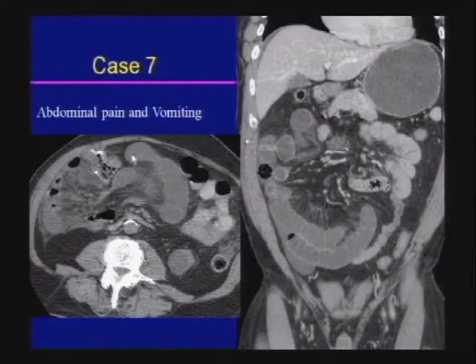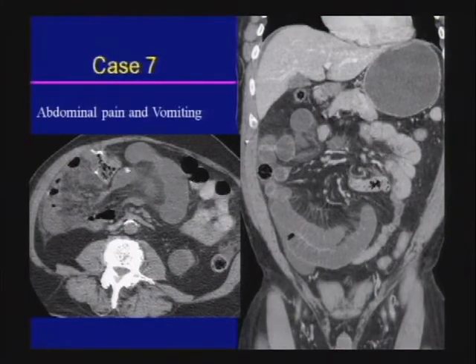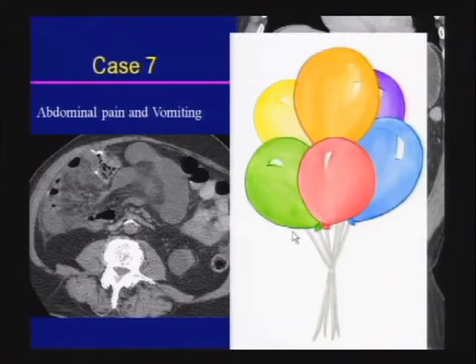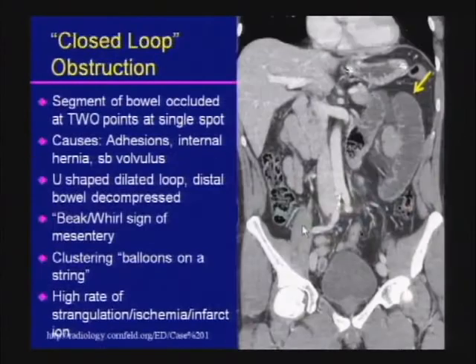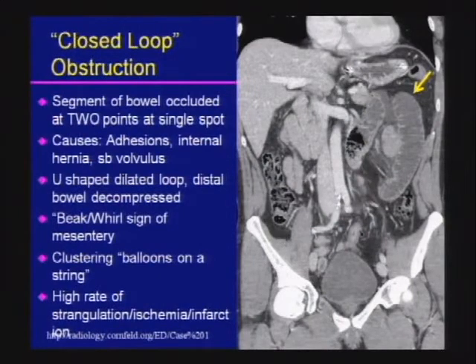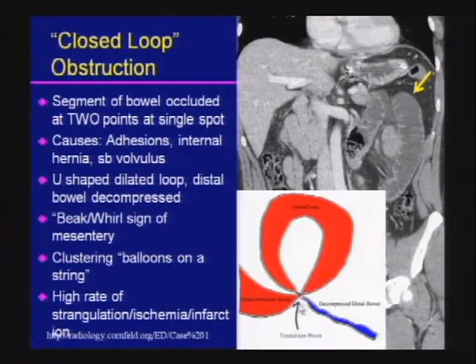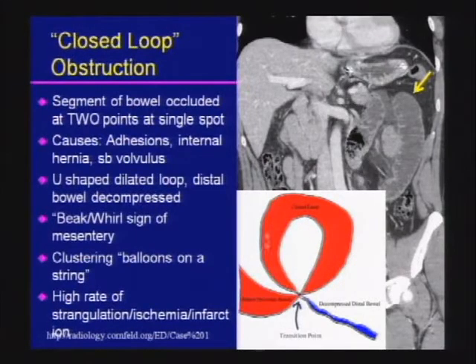A final case of small bowel obstruction shows a U-shaped, very dilated, clustered loop with mesenteric infiltration — a C-shaped loop as well — described as the clustering balloons on a string sign. This is a closed loop obstruction, a surgical emergency. The segment of bowel is occluded at two points in a single or very close location. Causes include adhesions, hernia, or small bowel volvulus. Because of the shape of a closed loop, it is predisposed to twist and volvulize, with a high risk of strangulation. Signs include beak and whirl signs, clustering balloons on a string.